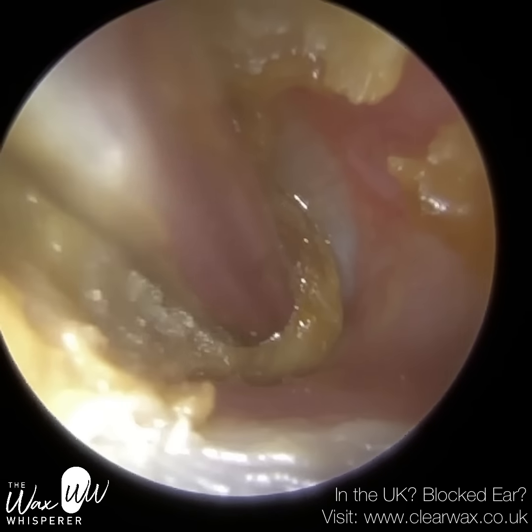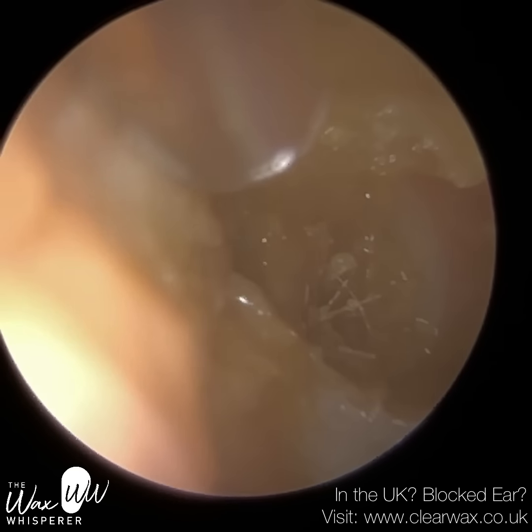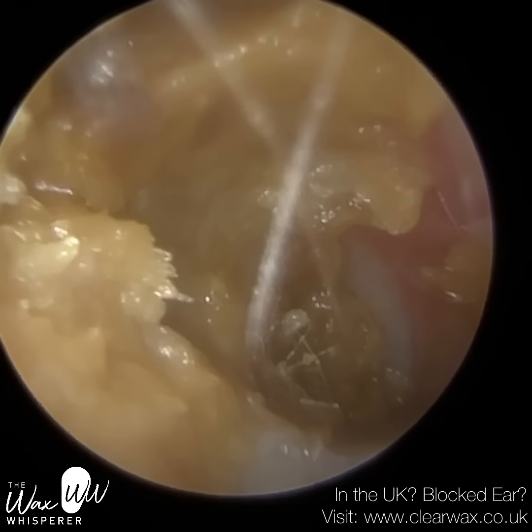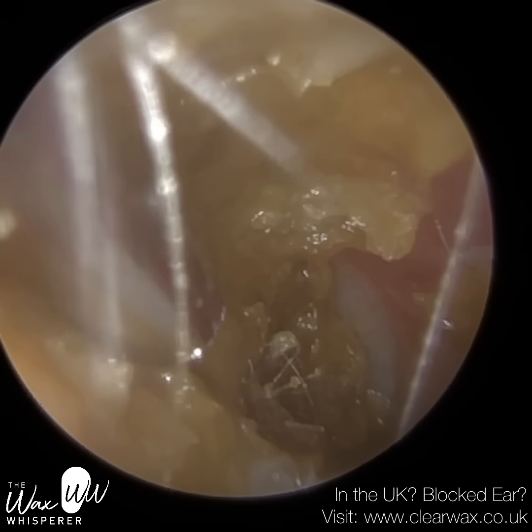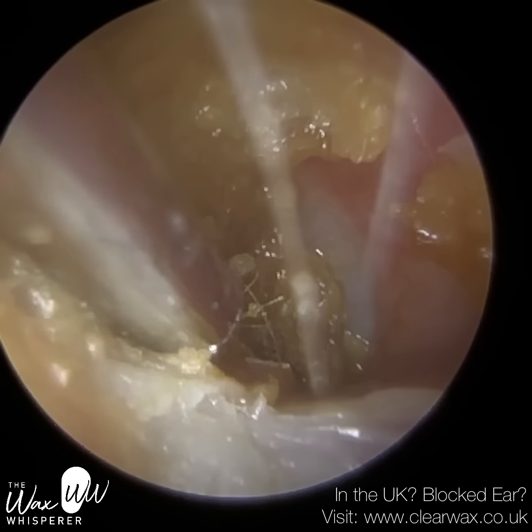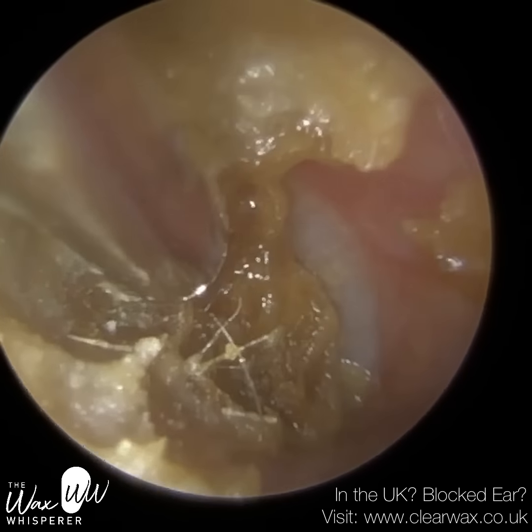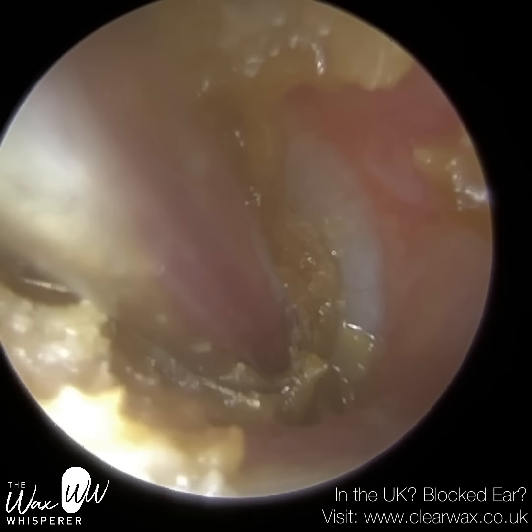The remaining mushy skin, you can see it's stuck to the eardrum. Just to the right of the screen you can see some of the eardrum — the posterior part — that's that blue tinge. It's quite difficult with this consistency of wax and skin because it's hard to suction; the mushy consistency can block the inside of the suction tube and reduce suction power. Therefore, I've instilled some olive oil earwax spray — it's medical grade olive oil spray that we use.